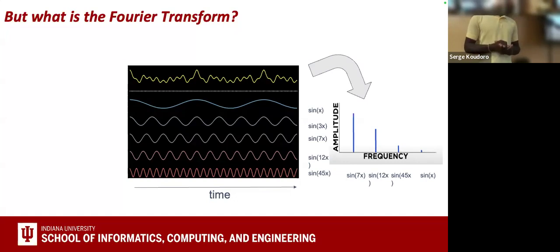So by applying the FFT to the signal, we went from the time domain to a frequency domain where we can better describe our signal. So the FFT principle is very simple to understand like this. Of course, the FFT can be applied to everything. Imagine that our domain is an image, okay?